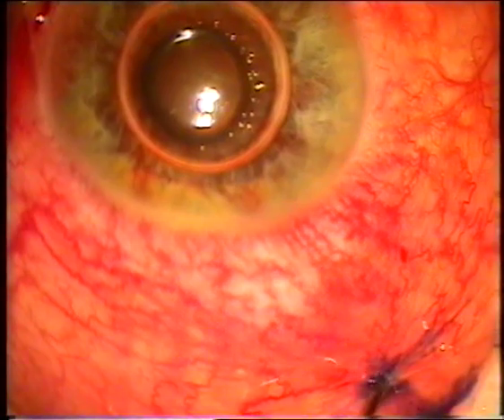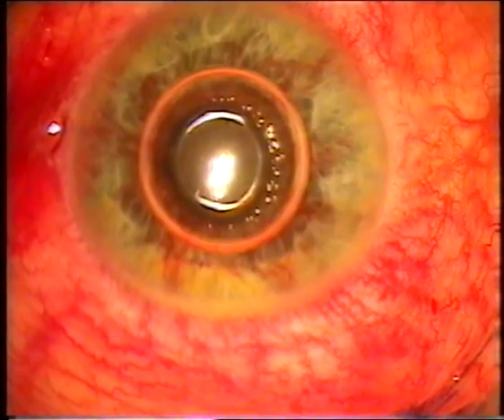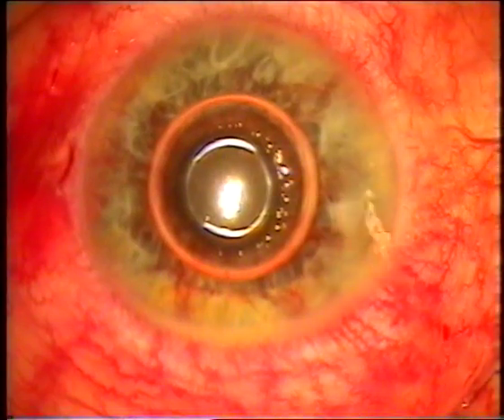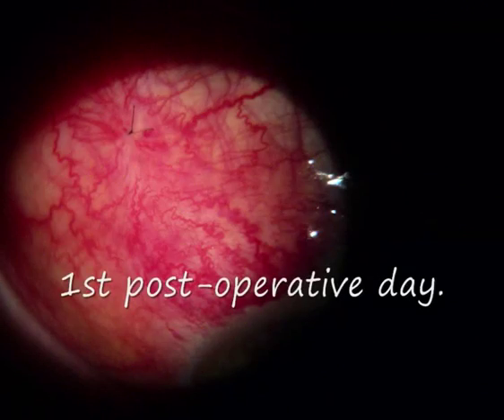This is the end of the surgery. We can see a well-formed filtration bleb; air is in the anterior chamber, the eye is soft. This is the first postoperative day after TCTF: some congestion is present, the filtration bleb is diffuse, and there is a well-formed anterior chamber.